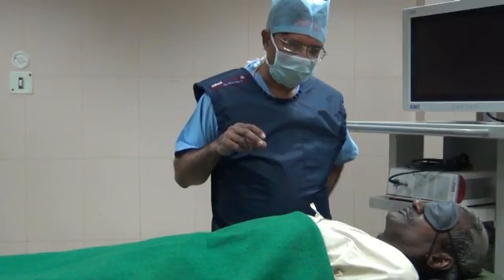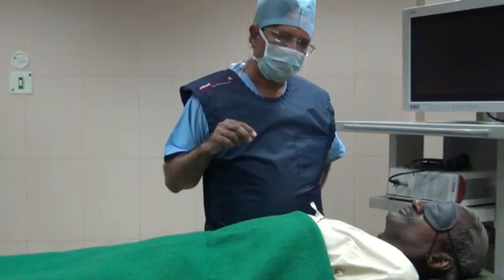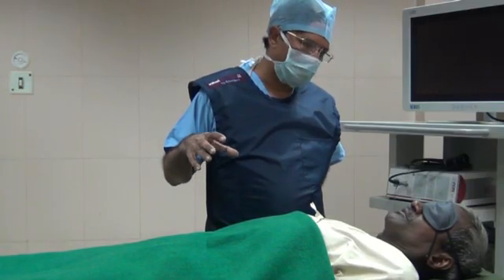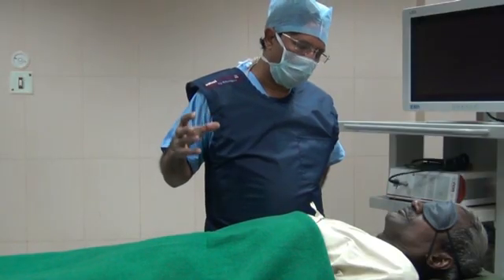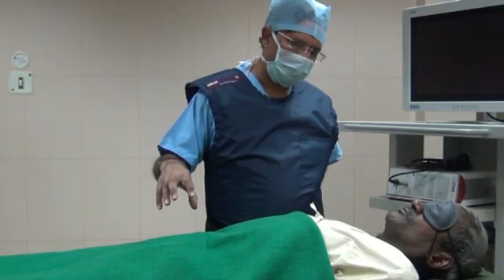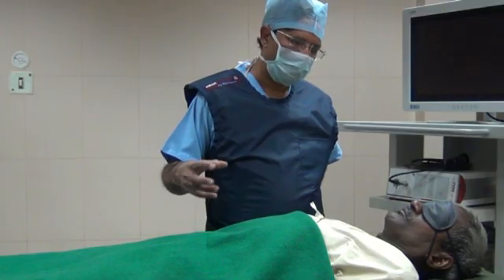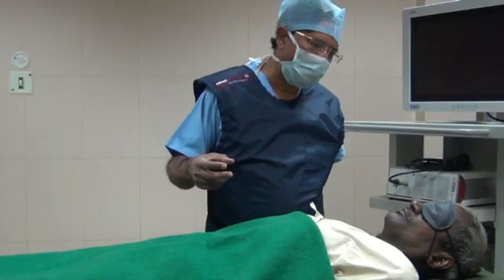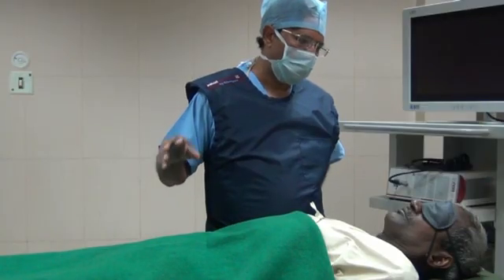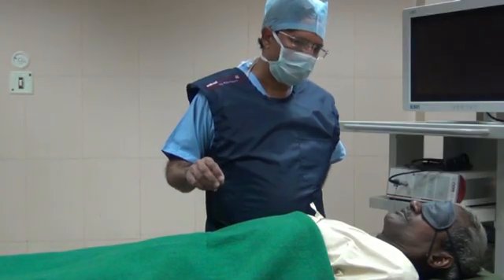the bladder. During the procedure, you will feel as if you want to pass urine, because we will be using irrigation fluid to inflate the bladder, your urinary bladder. You will have a feeling as if you want to pass urine. When you have that feeling, let me know. I'll stop the irrigation fluid, drain the bladder, and the feeling will disappear.